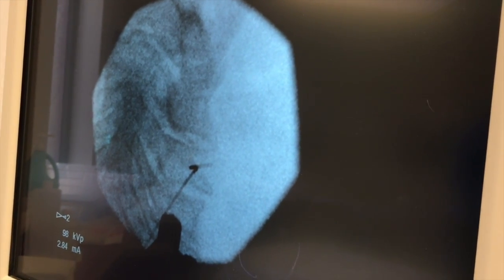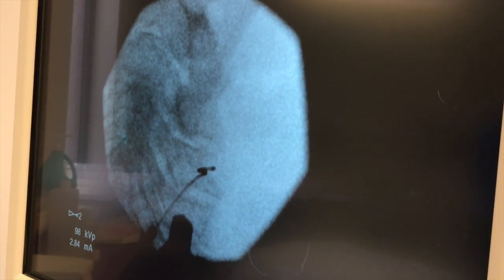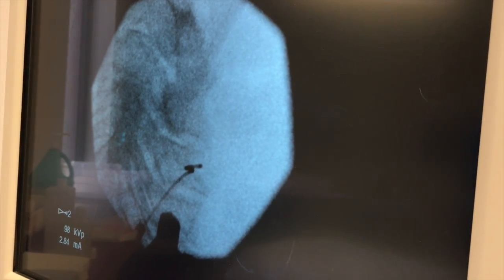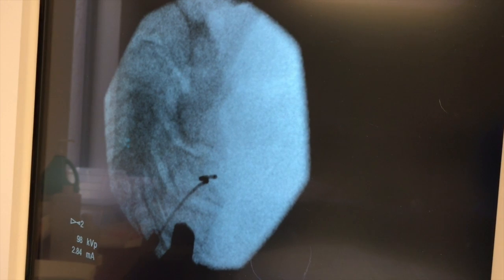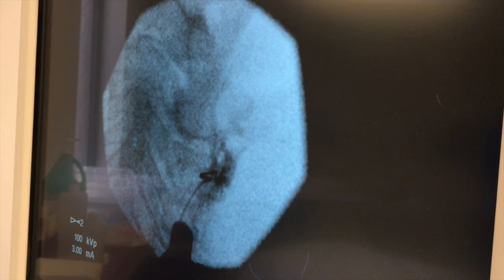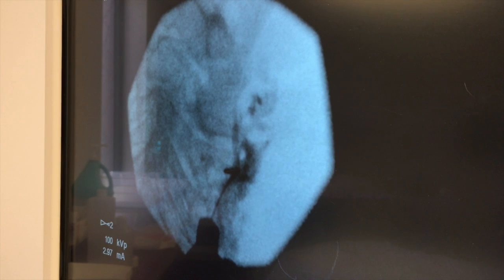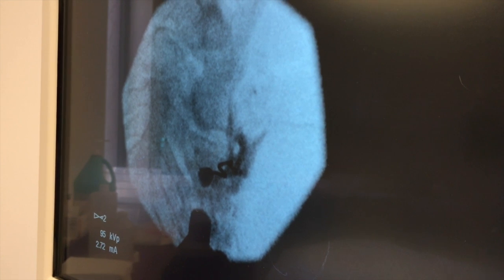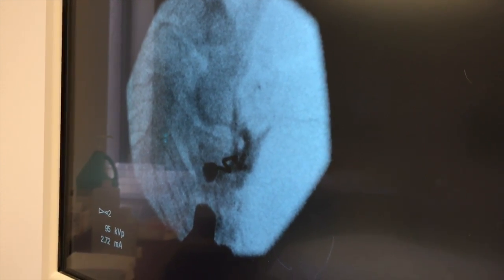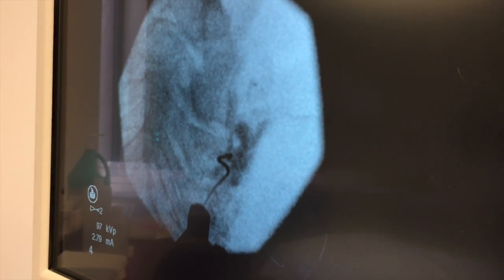You okay? Yep. Good. We're wonderful. There we are — right where we want to go. And we'll contrast again, making sure we're in the right spot. That's great. Right in there. That's perfect. No blood vessels. That's wonderful. Good. And spray it a little. There we go. That's great.